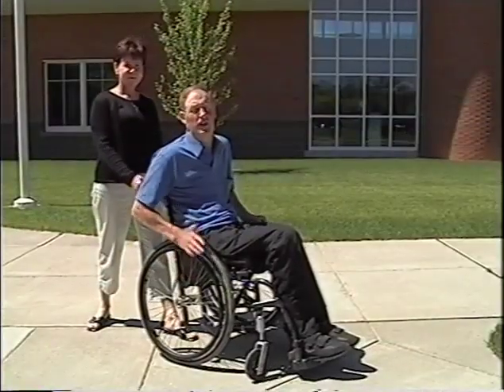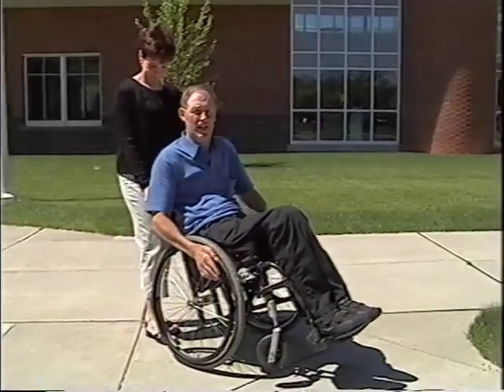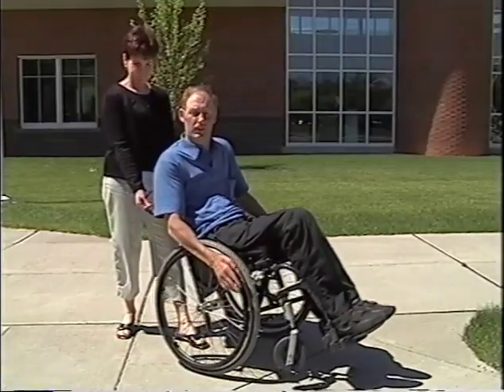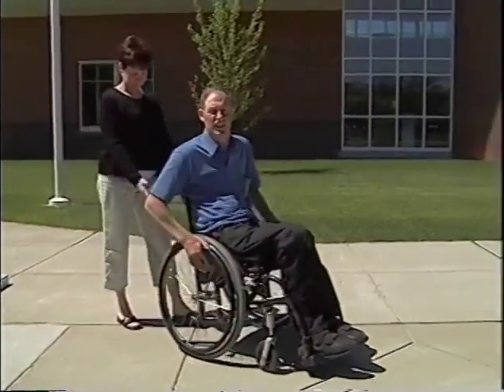And this will be very helpful when you're wheeling down ramps or over rough terrain, which you'll see in the future. Obviously, if you're just learning to do wheelies, you want to have a spotter behind you. Safety first, or as I say, when in doubt, chicken out. So with the spotter behind you, you'll have somebody that can catch you if you fall over. A very nice thing to have.